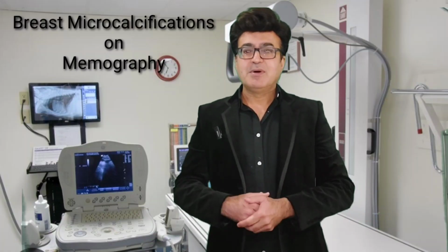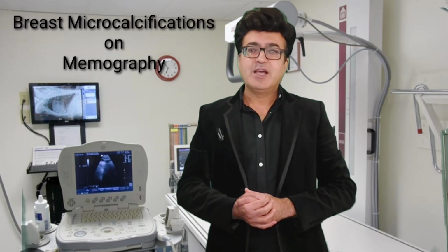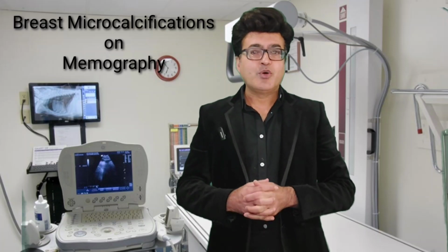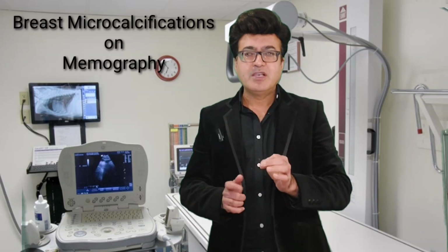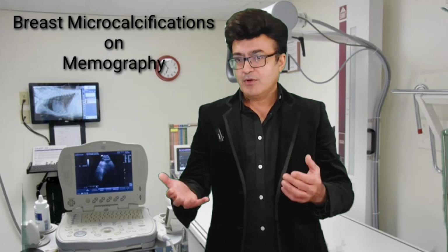I'm Dr. Arshad Nadeem Awan again with my ultrasound and radiology teaching video. Today I'm going to talk about the microcalcification which you can appreciate on the mammogram. There are microcalcifications which may be benign or may be malignant. So today I'm going to talk particularly about benign calcification. If you come across benign calcification, what it would be and how it would look.